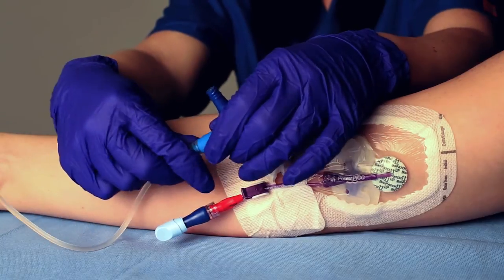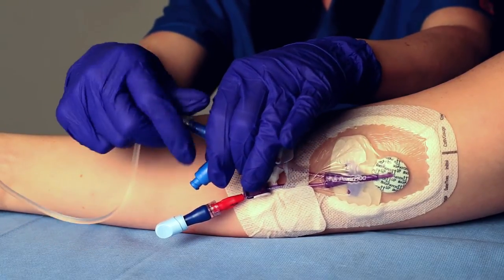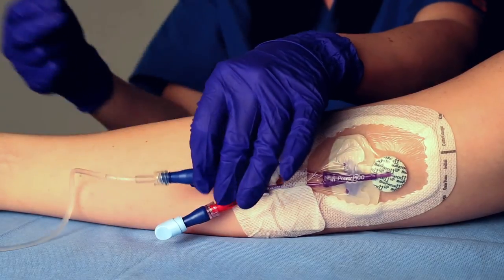Remove the dark blue dual cap from the male Luer by twisting until detached. Reconnect the IV administration set. Discard dual cap and do not reuse.